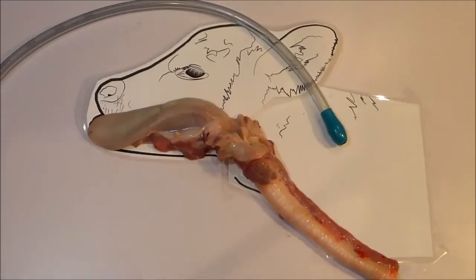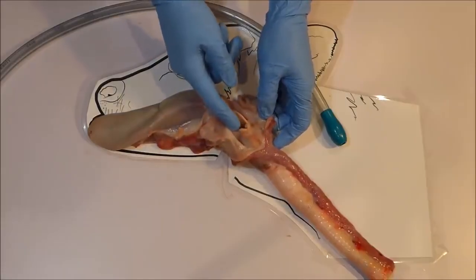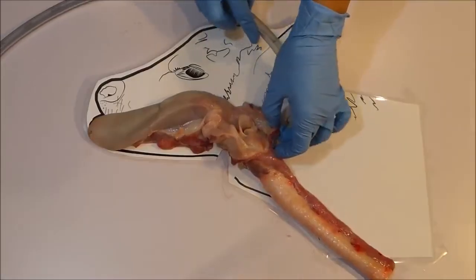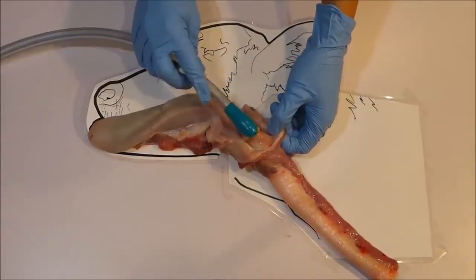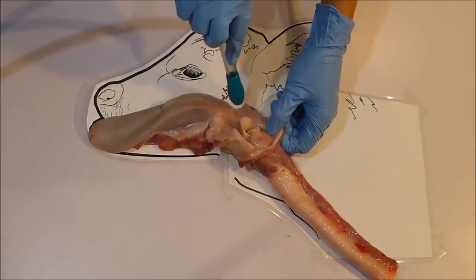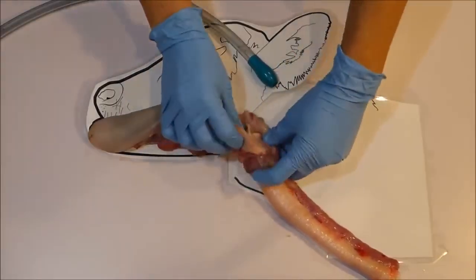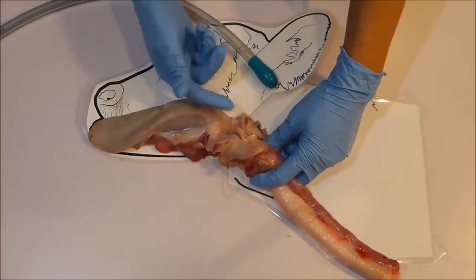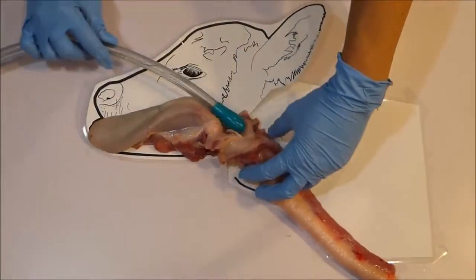Which side do I pass the tube is a common question. Gentle handling and gently passing the tube, leaving the placement up to the calf, is the most important tip. But to answer the question, if you were going to favour a side of the mouth to pass the tube down, it would be the calf's left side. The esophagus sits ever so slightly to the left so the left side is considered the better side. The airway entrance is in the middle, so if you pass the tube to one side it helps the tube avoid the centre and therefore the airway entrance. You can see with the top of the throat open that the airway entrance is quite vertical rather than horizontal, which is another reason why it is much easier to pass the tube into the esophagus than into the airway.